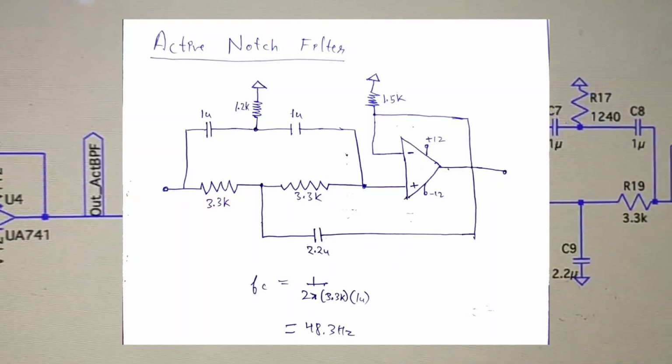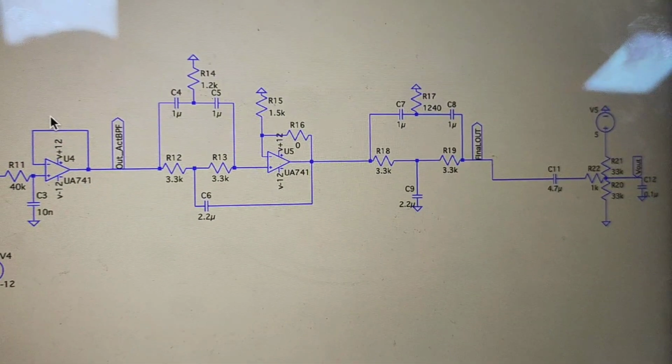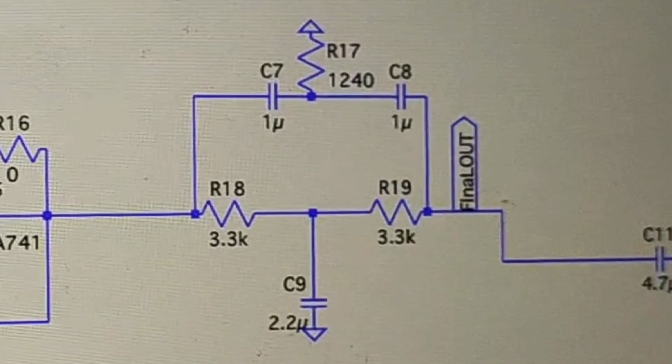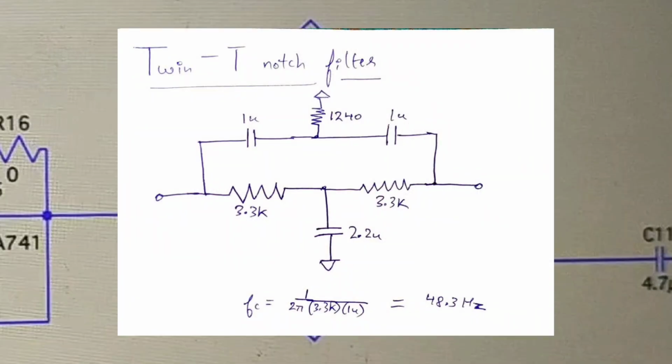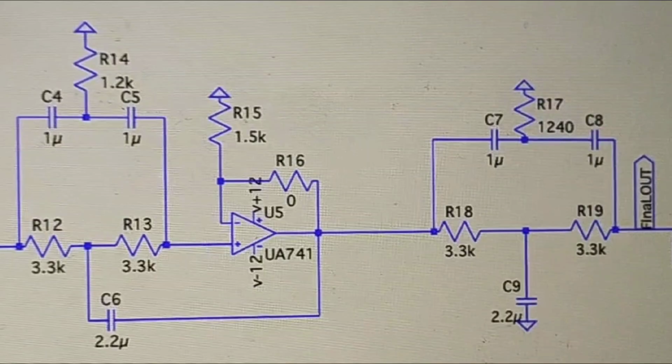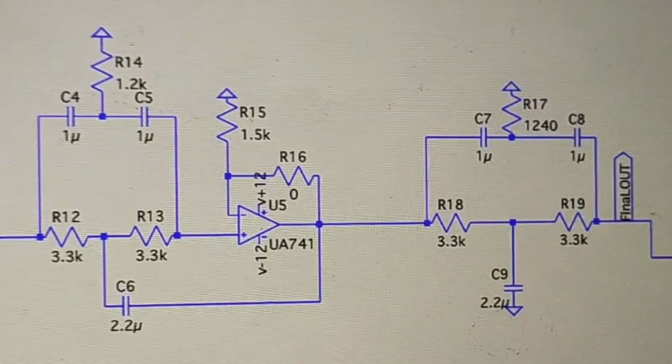noise in ECG recordings. One notch filter wasn't enough to completely eliminate power line interference, so we implemented a second notch filter using a twin T configuration. This active twin T filter provides deeper attenuation at 50 Hz. We calculated the notch frequency to be approximately 48.3 Hz. Having two notch filters in cascade significantly improves the rejection of 50 Hz noise, potentially providing up to 50 decibels of attenuation at this frequency. The twin T configuration offers a sharper notch than a single stage filter.